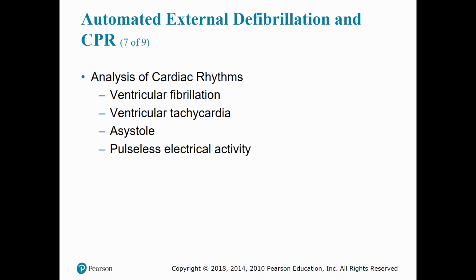All right. Analyzing cardiac rhythms: VFib, VTAC, asystole, and pulseless electrical activity. VFib is a disorganized cardiac rhythm that produces no pulse or cardiac output. Associated with advanced coronary artery disease, 50 to 60% of cardiac arrests are in VFib during the first 8 minutes after becoming pulseless.